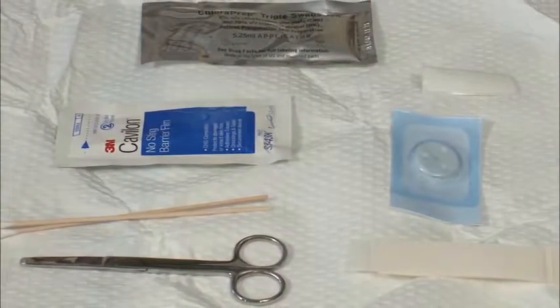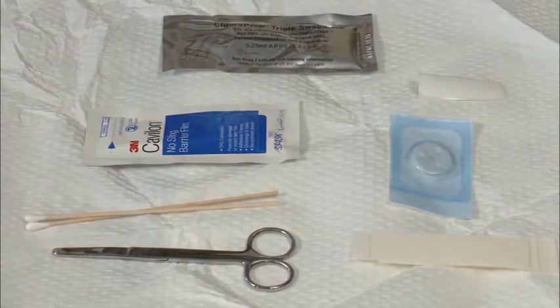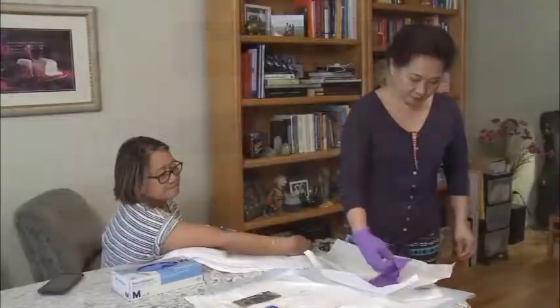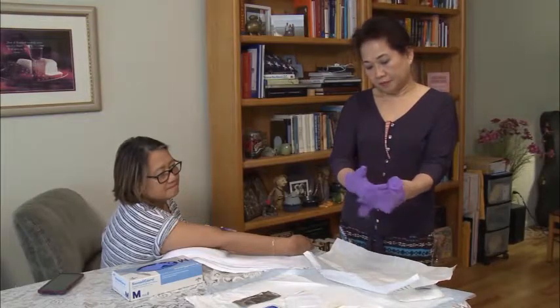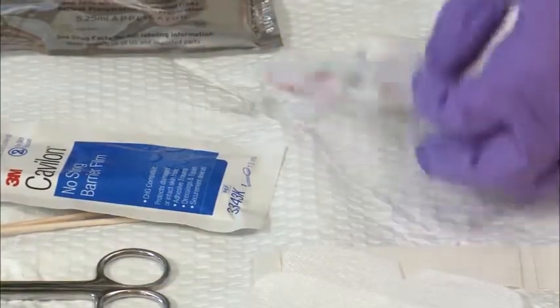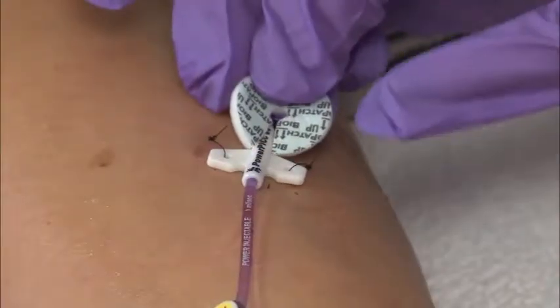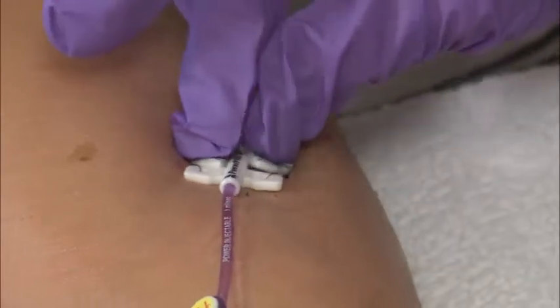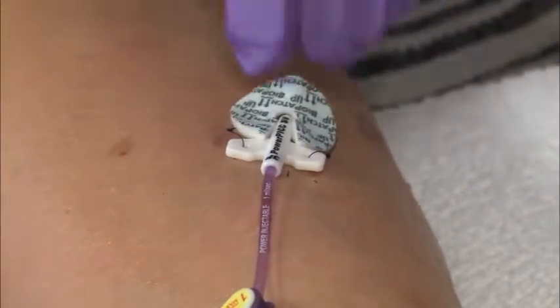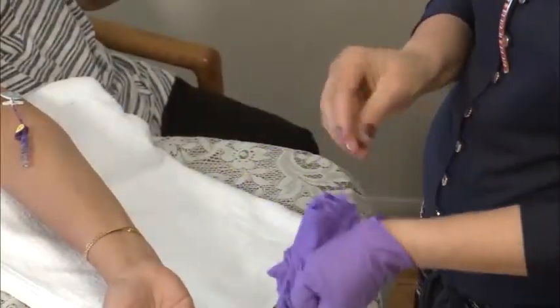When using the dressing with the antiseptic disc, you need to carefully open the appropriate dressing cover onto the sterile field. Follow the same steps in cleaning the CVC site as shown in the transparent dressing. Before removing your gloves, peel open the small, round antiseptic disc. Place this disc with the white side down and the blue tinted shiny side up around the catheter insertion site. This does not stick to the skin, so be careful not to move. Remove your gloves.